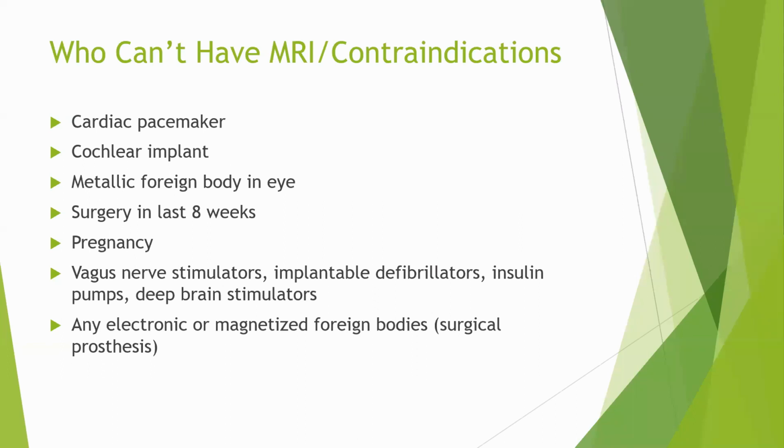He or she can certainly go in for X-ray and CT scans, but not an MRI, because it's a magnetic resonance. It will magnetize the metals. So that's the reason. So surgery in the last 8 weeks, if the surgery does not involve any metal implants, then it's actually fine. Not a big deal, not a contraindication.